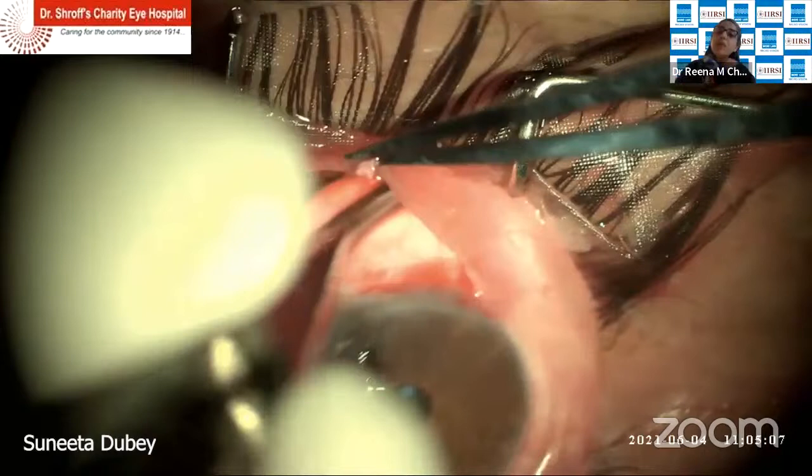The other thing to remember is that in the post-operative period, Ologen bleb morphology is very different from MMC blebs. Even in the early post-operative period, you cannot manipulate just on the basis of intraocular pressure; we have to remember these blebs look different. They don't look like those raised MMC blebs. They are shallow blebs where you can see the disc over a period of time start to get absorbed and disappear, but what you are left with is a shallow bleb that is functional. So the take-home message is that you can use it in certain conditions if the patient can afford it, but not in every patient, because it may not give you any advantage.